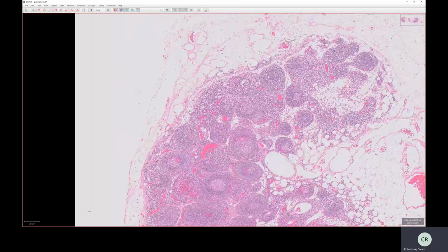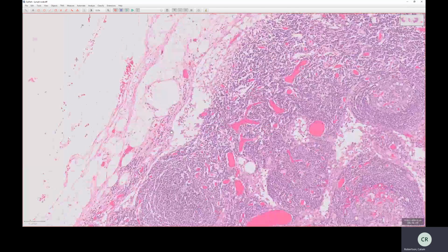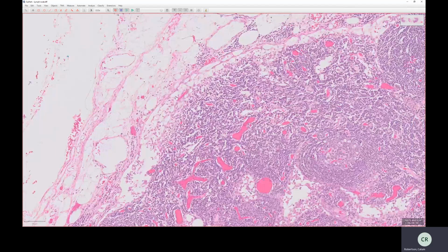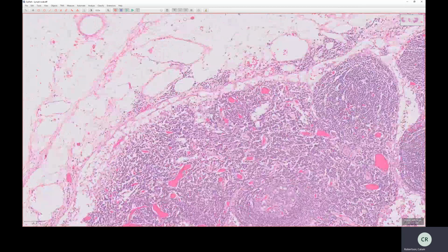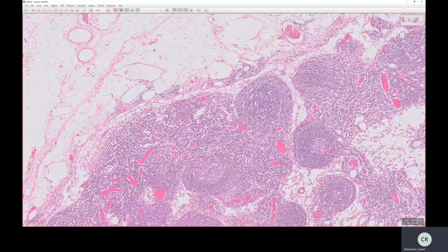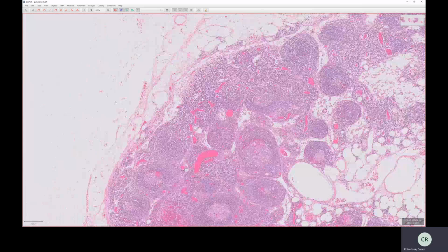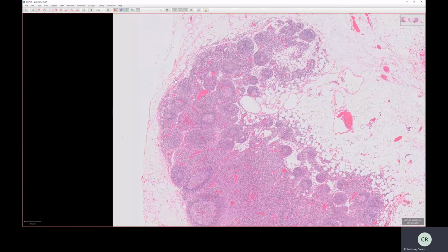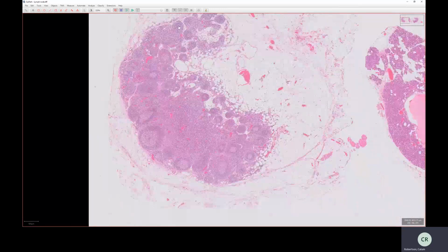That is the first port of call for draining lymph that's draining through the lymphatics into the node. So if you're looking for carcinoma, if this is a lymph node that's draining a known carcinoma, the subcapsular sinus is a really good first place to look. If it isn't obvious that the carcinoma is within the lymph node, go down around the subcapsular sinus at ×10 magnification to see if you can find any small aggregates of carcinoma. Anyway, it's an aside. So we've got the capsule, subcapsular sinus, and the next part is the cortex.